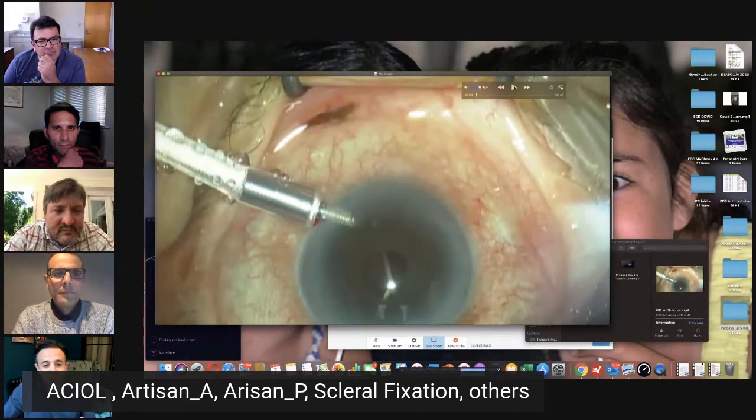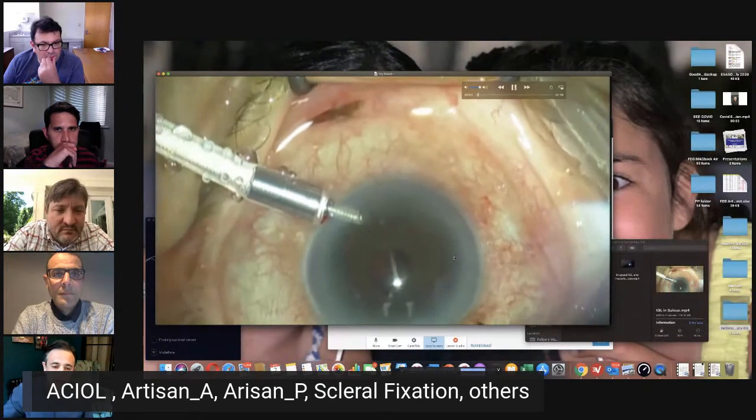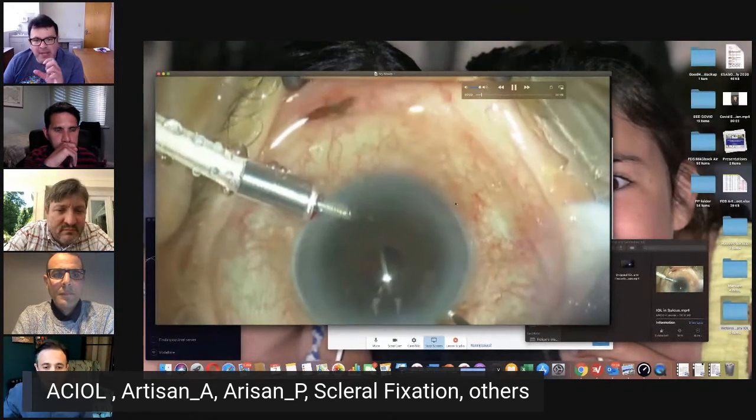So this is a patient with a very small pupil. I think he had pseudoexfoliation. He had a complicated cataract surgery. He came to me. I usually try and leave a secondary IOL for a little bit later. I leave them, you know, 2-3 weeks, 4 weeks, if possible, and there is no dropped lens.